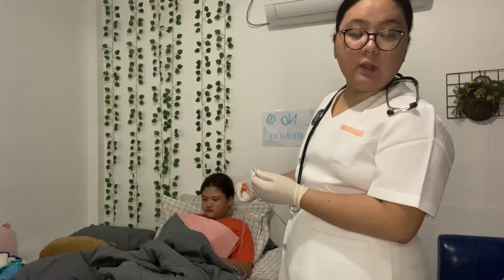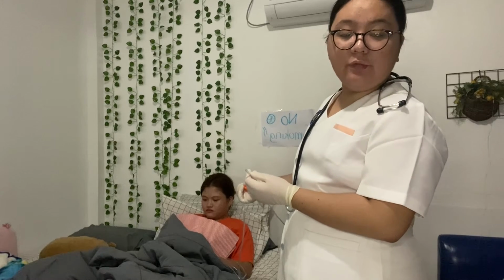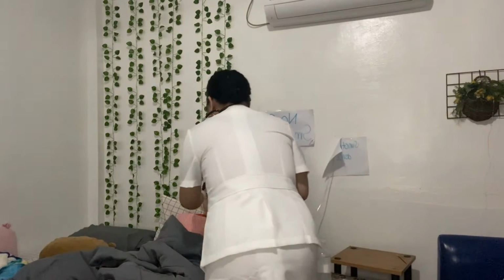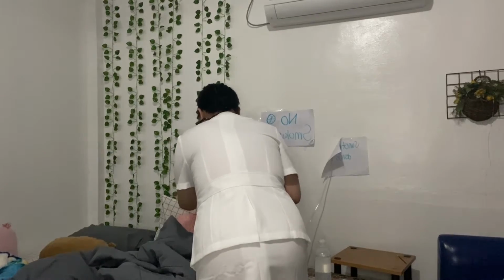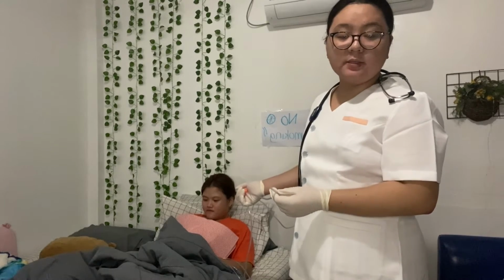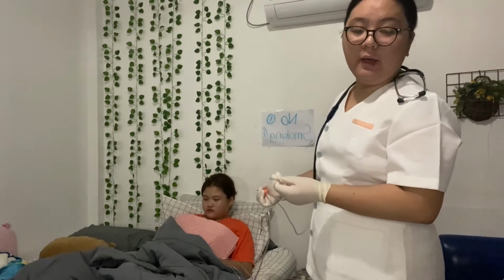Slowly withdraw catheter while rotating back and forth between the dominant thumb and fingers. Encourage the patient to cough. And then after that, replace oxygen delivery device and encourage the patient to have a deep breath.